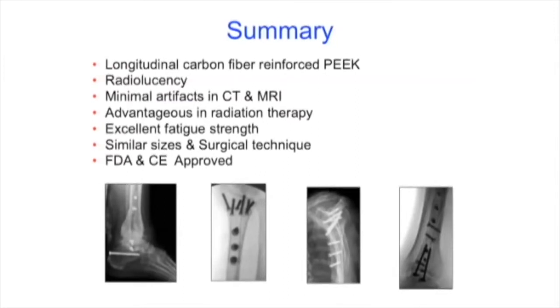I'll say this. All the femoral nails that we've done over the year and a half have been retrograde, because the nail is, in essence, a piriformis nail. So you can either go piriformis or retrograde, and my partner and I have an affinity for going retrograde. It's just a lot easier. We've done close to about 40, 50. We lost count of how many we did in the past year. And we haven't had any issues of synovitis. So it's so far been promising.